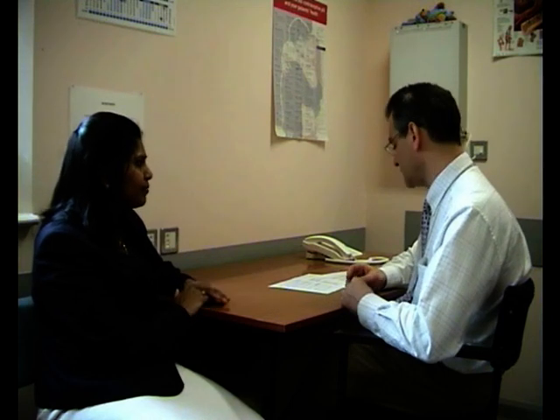And then we'll still continue to fill your bladder up till you can really bear it. And then we'll ask you to do a lot of things like cough, jump around and things like that. This is really to make you leak, because the main reason of this test is to find out why you're leaking. And then I ask you to empty your bladder again, but this time with the tubes in place, so that we can again measure the pressures as well. Then the computer will give us the results in graphs, so that we can then talk to you about the results. Excellent, that's perfect, thank you.